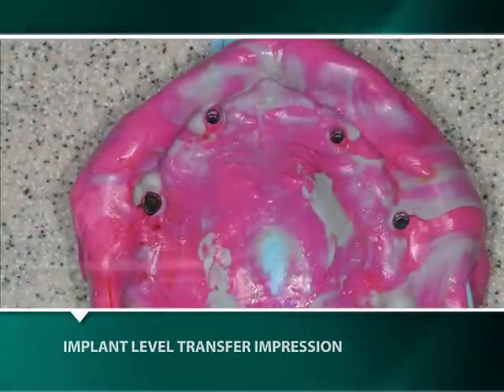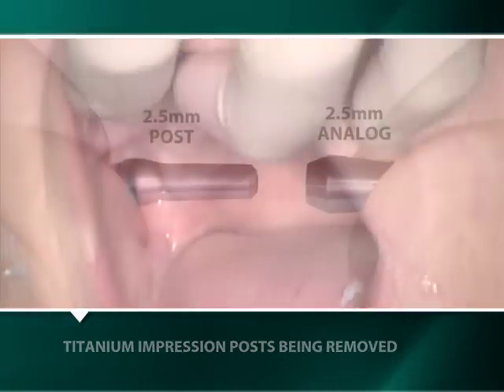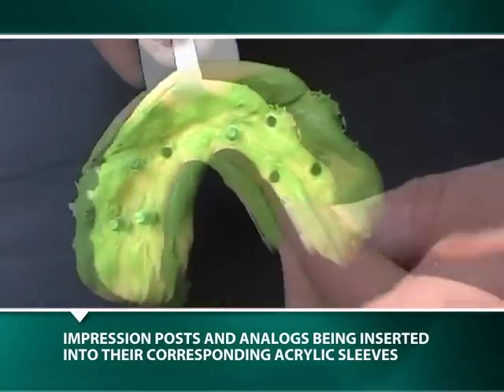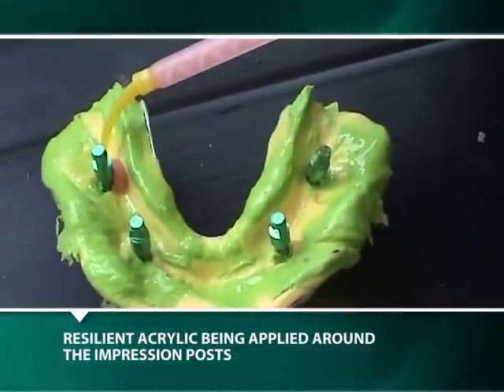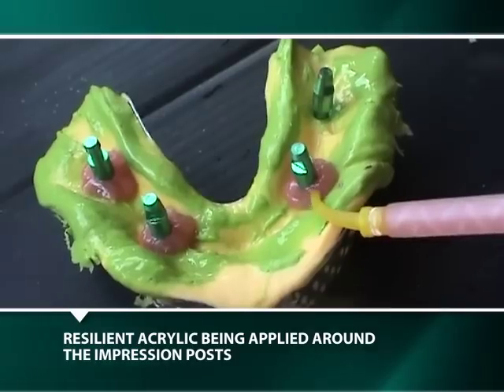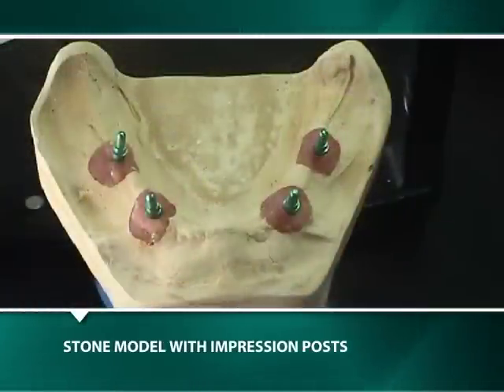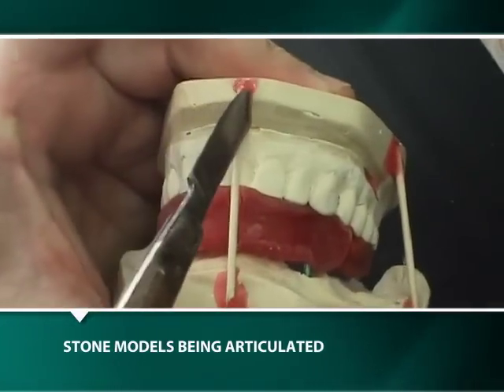Upon removal of the full arch impression, remove the red, blue, or green impression post from the implant wells and insert them into an implant analog of the same color, prior to inserting them into their corresponding acrylic sleeves within the impression. Prior to the pouring of a stone model, a resilient acrylic is applied around the impression post to simulate a soft tissue contour in the stone model. The stone model is either used for the fabrication of a wax rim, or, if a bite registration had already been made, it is articulated with its corresponding stone model.